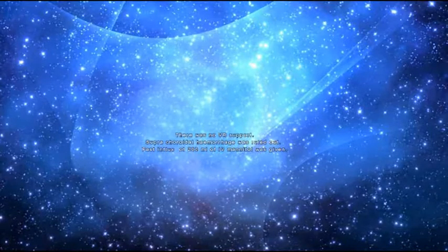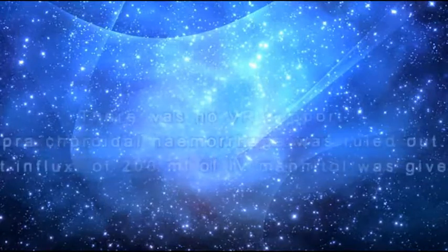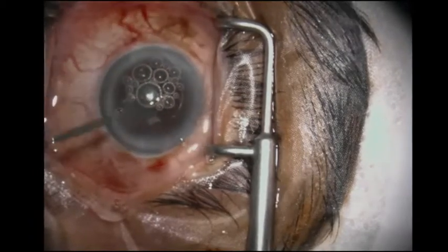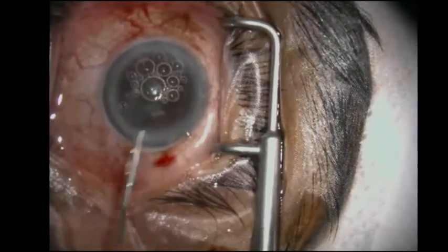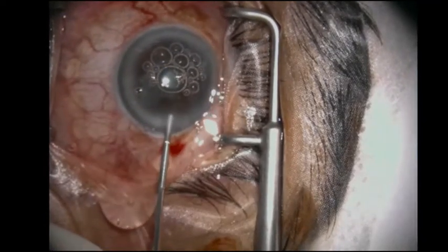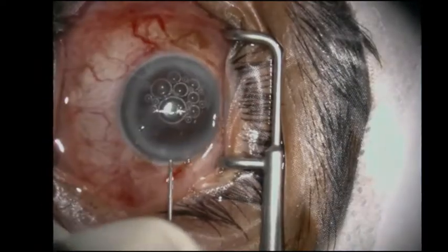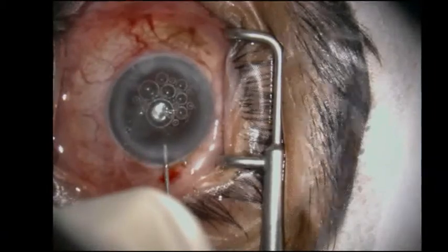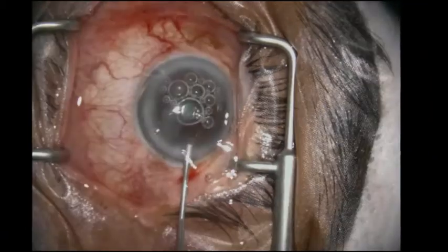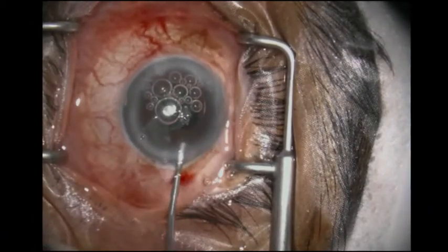Fast influx of 200 ml of IV mannitol was given. The patient was again taken up. The cornea was tapped and IOP was found to be normal. Visco was injected. Intracameral adrenaline was injected for pupillary dilatation. The air in the AC was managed partially with visco substitution.